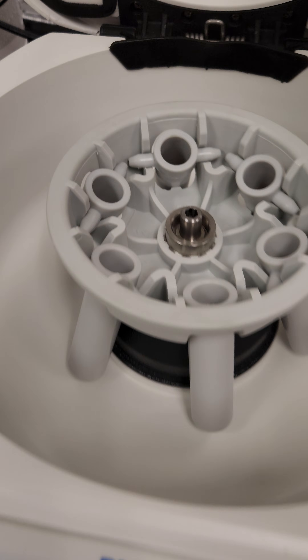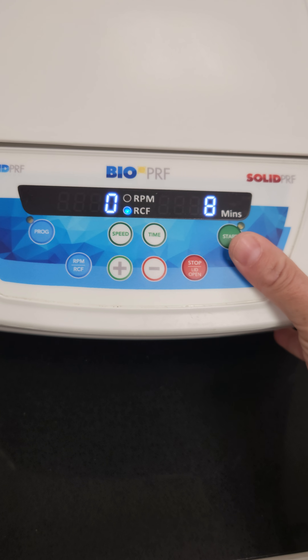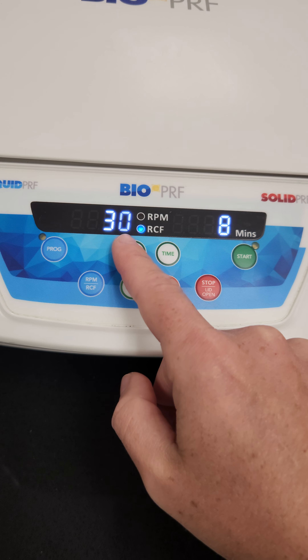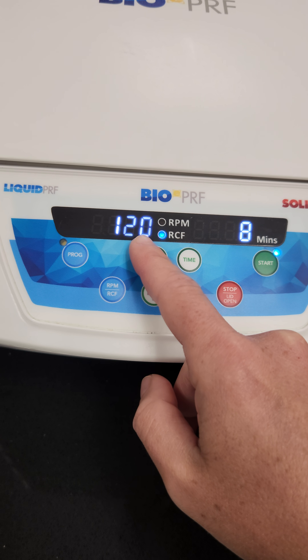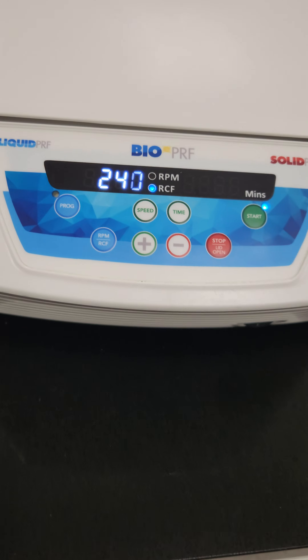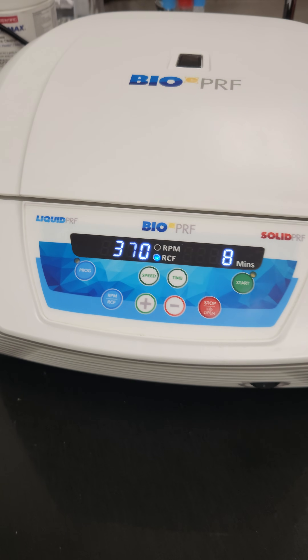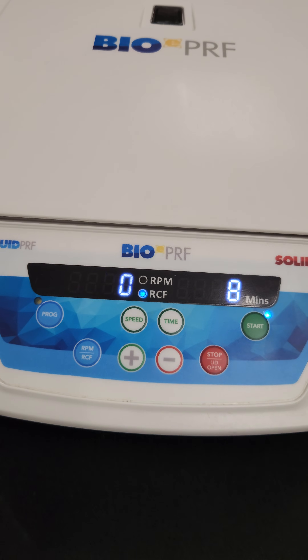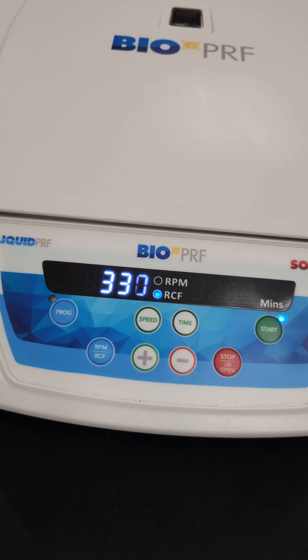To start it, you're going to close the lid and hit the start button. You'll see it go down to zero and now it's picking up speed again. If you need to stop it, just hit the stop button and you'll see that speed come right back down.